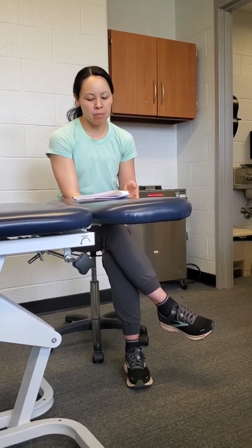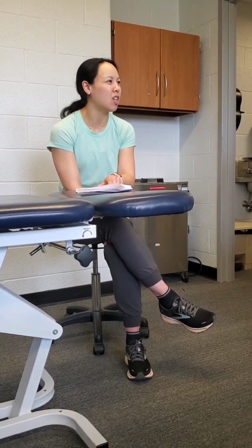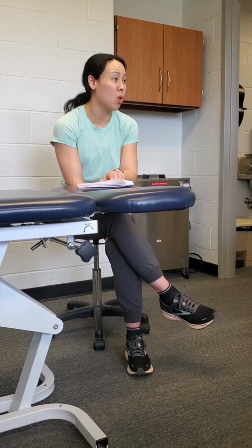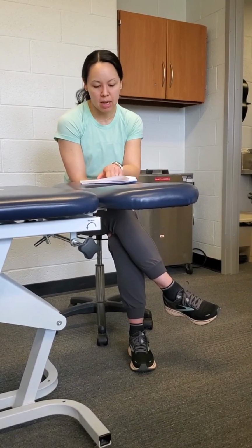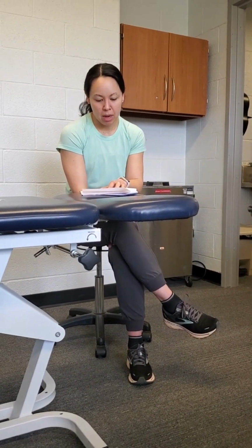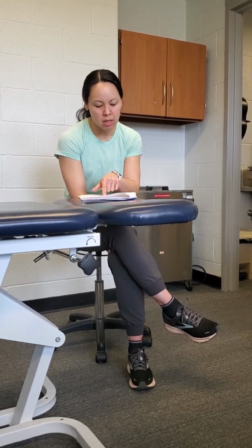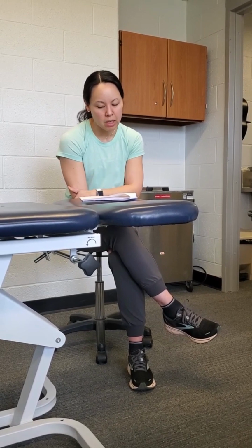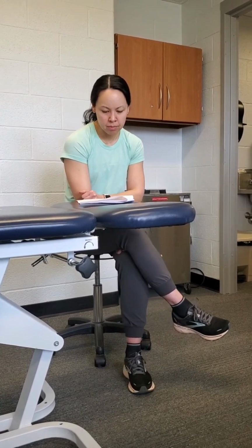I thought that was really interesting because tendinopathy patients with BFR wouldn't have been my first thought. But if they're really struggling to do any type of exercise, even body weight, like someone trying to do a stationary lunge and they can't even tolerate that, if their pain's above a 4, you might want to try some BFR and see if that helps modulate their pain a little bit. It's been having some positive effects in some of the studies. There was an Achilles tendon study, a patellar tendon study, and even a tennis elbow study showing that. This might be getting into the weeds a bit, but I can definitely see its use for pain management.